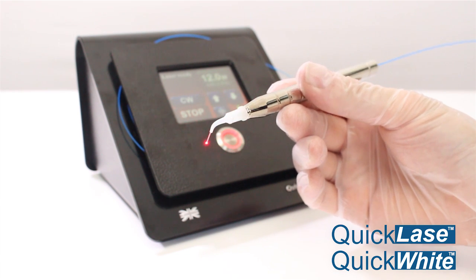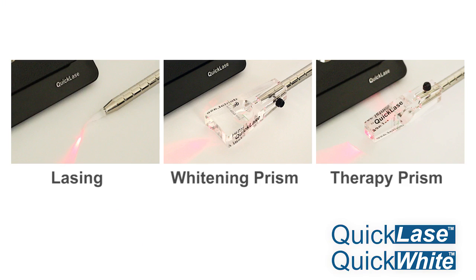The all-in-one, balanced, lightweight handpiece is used for lasing, whitening and therapy procedures.